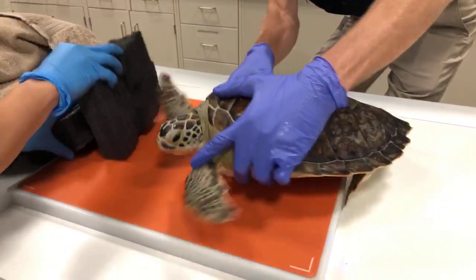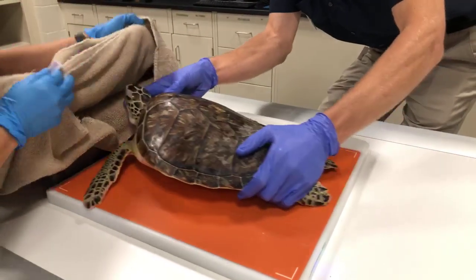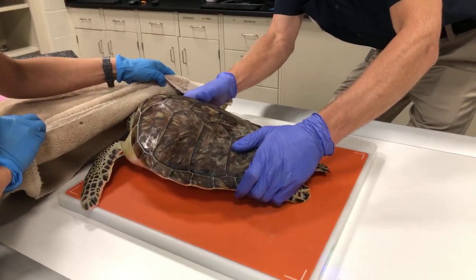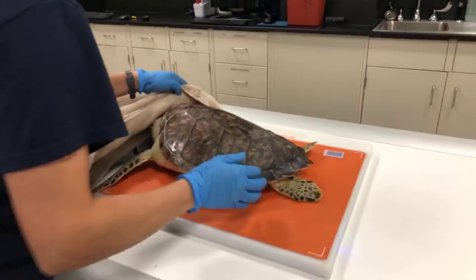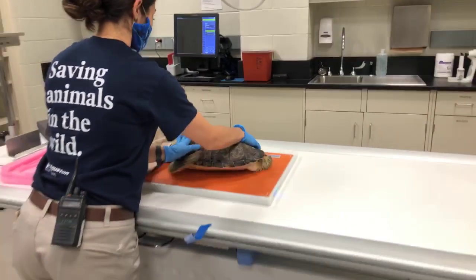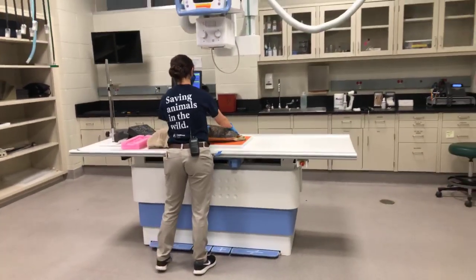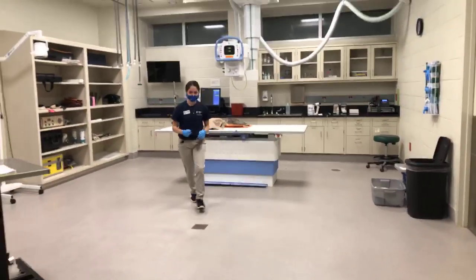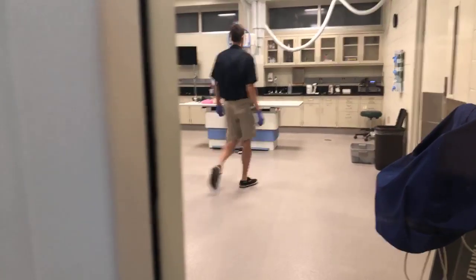Dr. Joe, how do I know it's a green sea turtle? It doesn't look green. Well, green sea turtles actually got their name as green because people used to eat them, and the fat inside is green because of all the algae and seagrasses that they eat. Now we need to step back because we're about to take an x-ray. And we want to make sure that we don't get any unneeded exposure to radiographs. So Jennifer is working with the turtle, getting it to be calm. It can be very difficult to get a green sea turtle to stay still long enough to take a good x-ray.